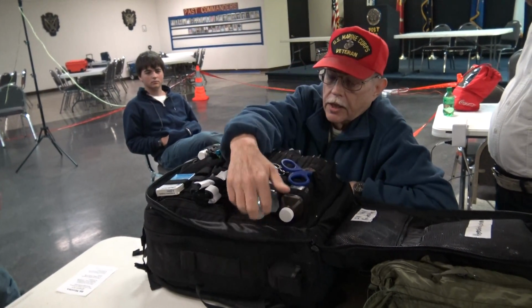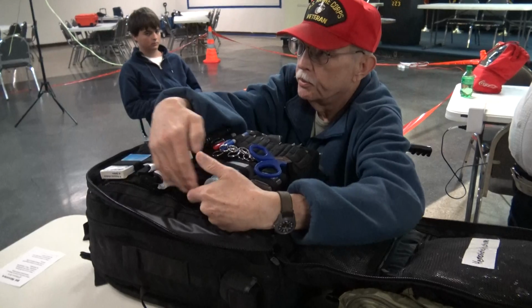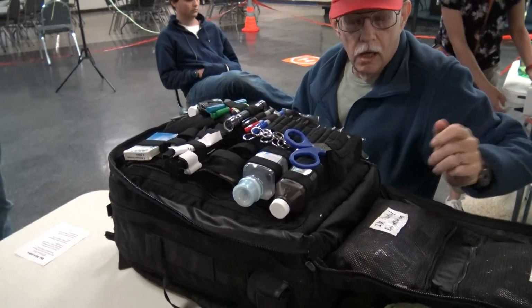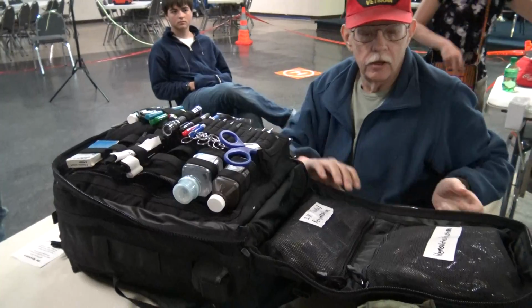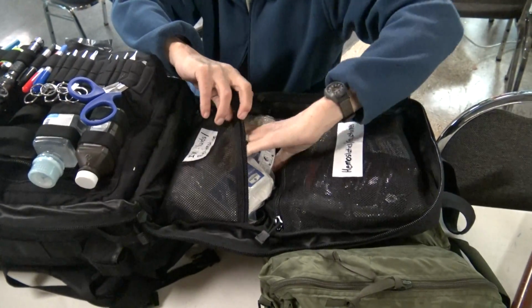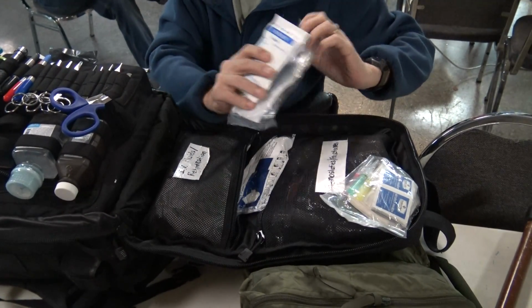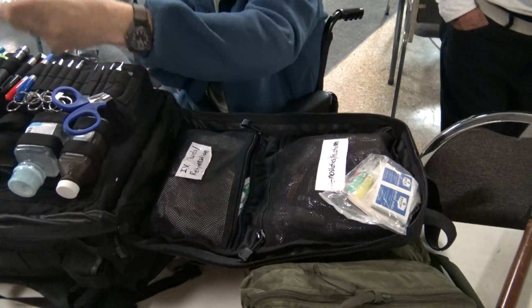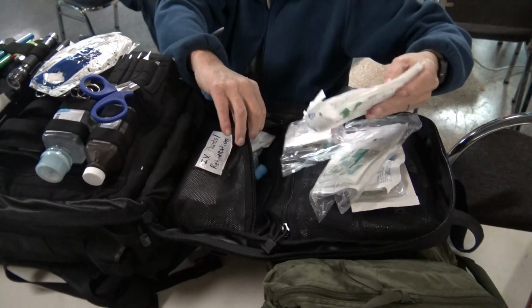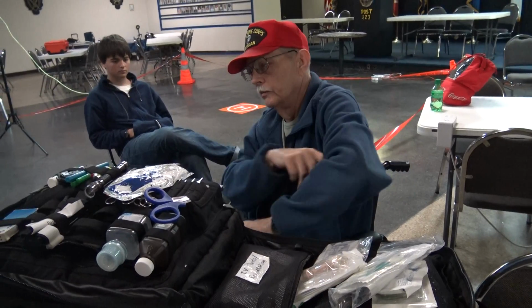people. On the other side in here, unfortunately, it's not in there today because my wife was pushing me and I forgot to put my blood pressure cuff and the stethoscope back in on this side, but that's where it goes. Down here on the lid, we've got IVs and hemostats, all the lines and stuff for setting up IVs and whatnot. Oh, this is a little tourniquet so you can put the needle in.